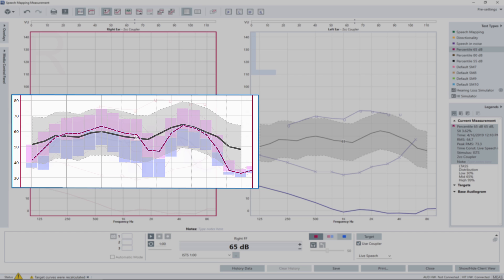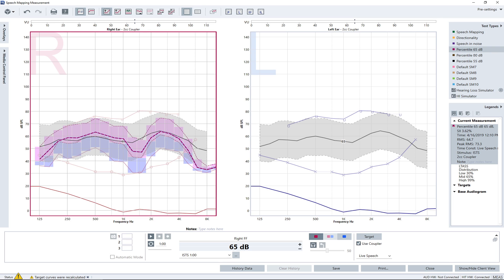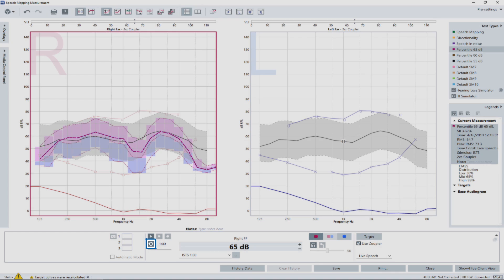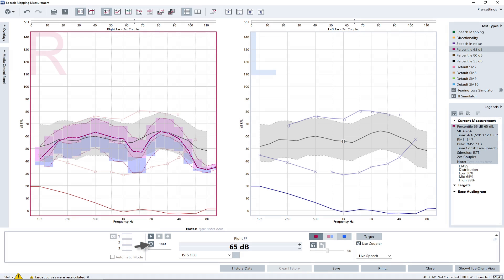Use the manufacturer's fitting application to adjust the hearing instrument output level represented by the dashed LTAS curve to match the target. To see the changes applied in the hearing aid settings more instantly in the measured curve, activate the loop function located below the play button. This allows the measurement to run continuously, taking an average every five seconds to react quickly to changes.